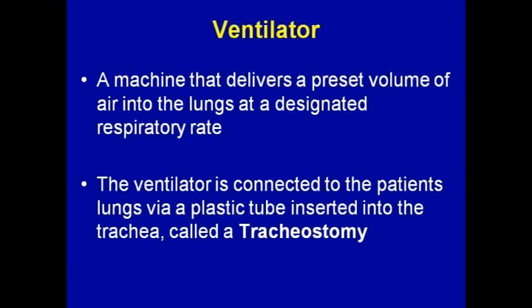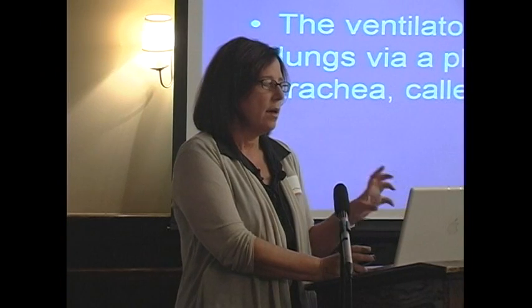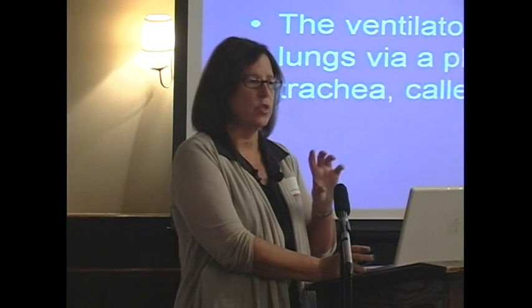So a ventilator is a machine, and I think there'll be a talk later from Respironics about one of the types of ventilators, but it's a machine, also very small now with our advanced technology, that rather than delivering a pressure, which is what the BiPAP or the non-invasive ventilation delivers, a ventilator delivers an actual volume.